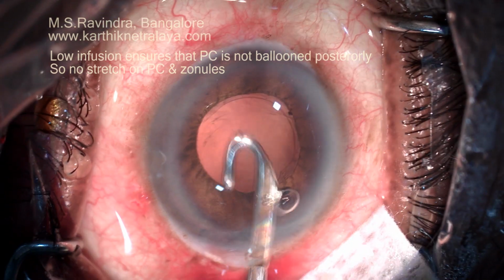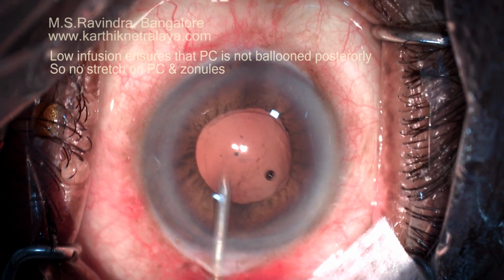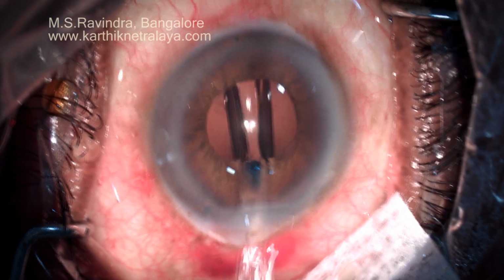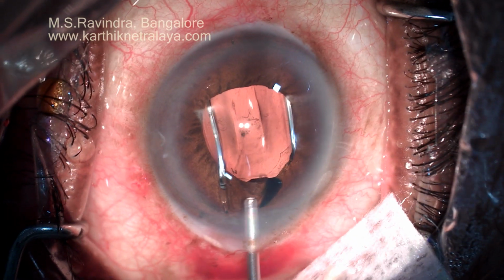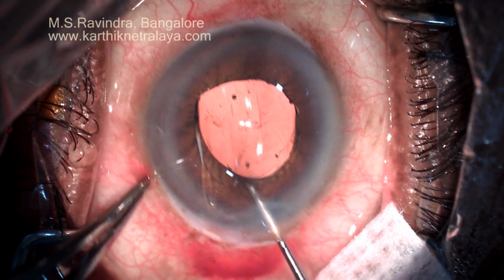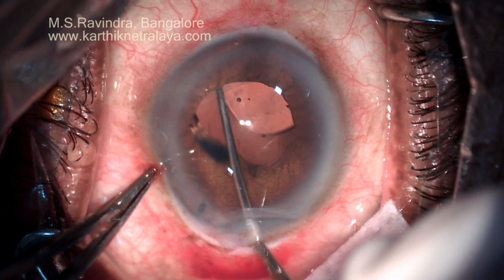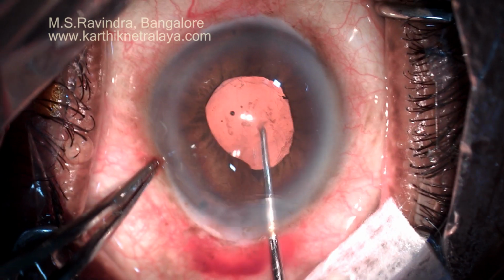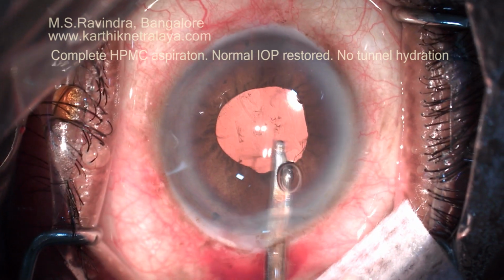As there is no side port, the subincisional cortex is aspirated using reverse Simcoe cannulas. The IOL is injected into the capsular bag, ensuring that the haptics go in the capsular bag. Complete cortical aspiration minimizes postoperative inflammation, and the IOL is now rotated into the capsular bag. The zonules are weak in this patient because of long-standing glaucoma as well as the medications that the patient has been using for a long time.